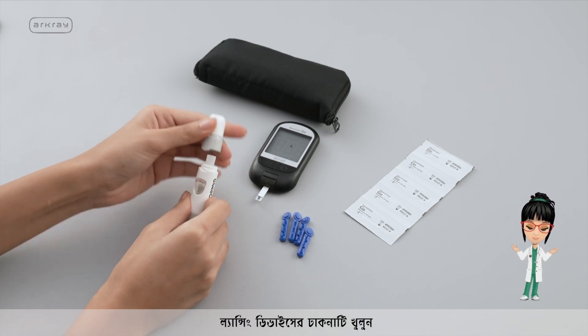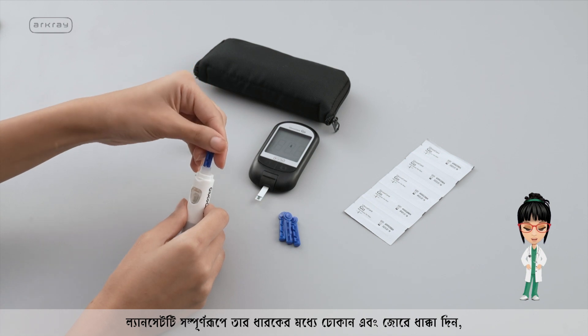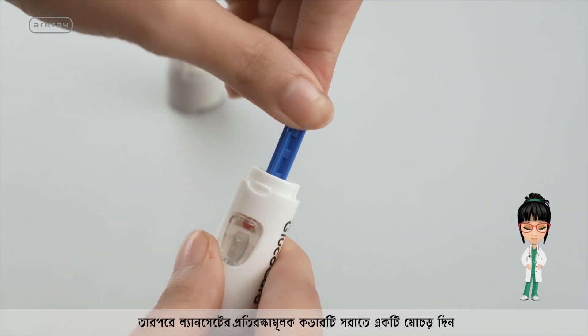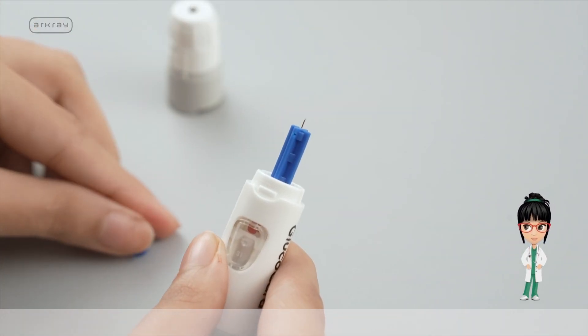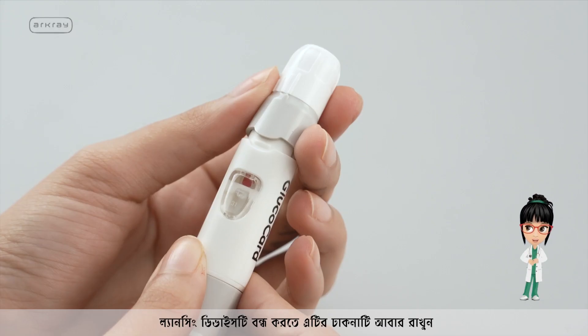Open the lid of the lancing device. Insert the lancet into its holder fully and push hard. Then twist it to remove the lancet's protective cover. Put back the lid of the lancing device to close it.